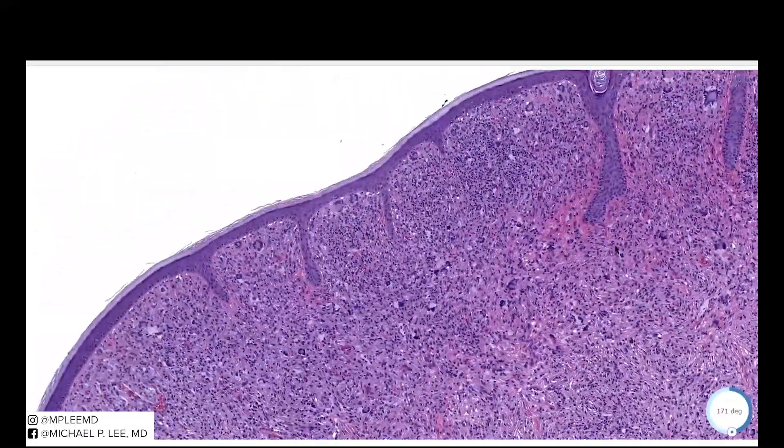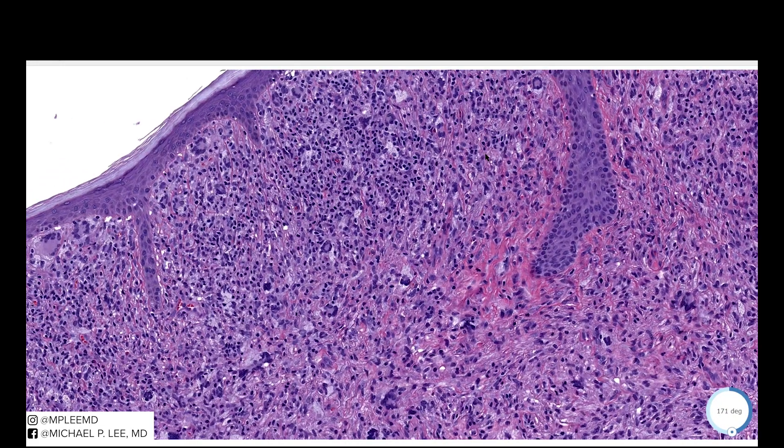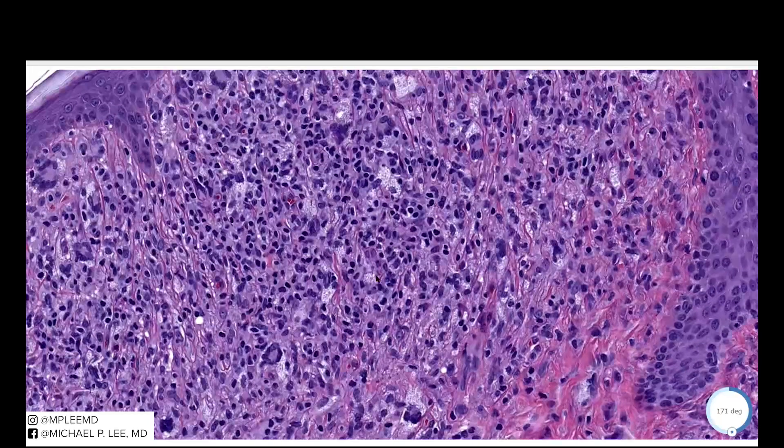Coming up to this first region, you can see some of these darker bluer cells — these are lymphocytes. Scattered in between we have these pale cells with a foamy or granular cytoplasm. These are macrophages that have lipid in them, so we call these foamy macrophages.